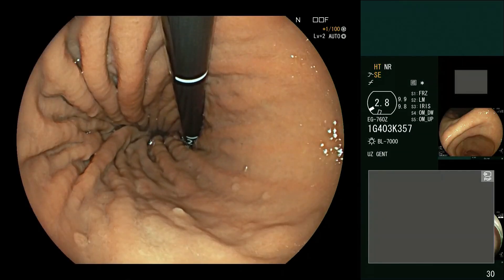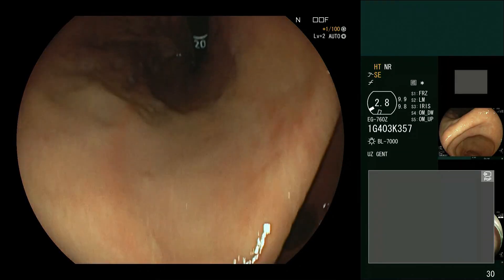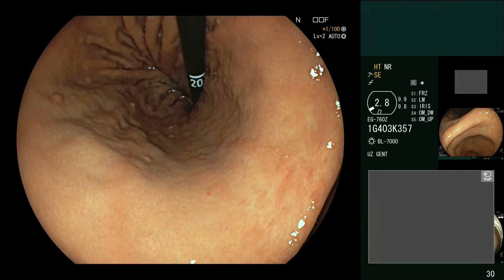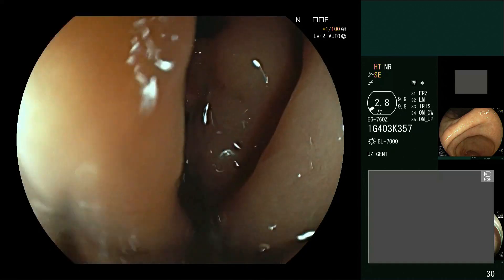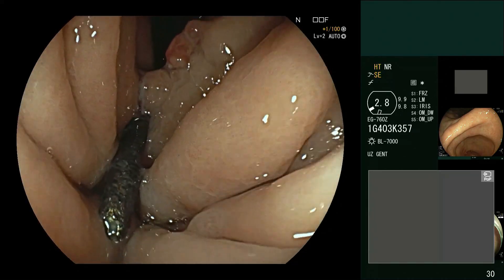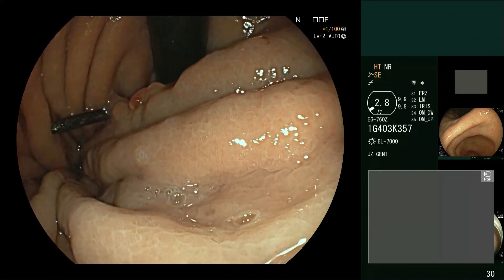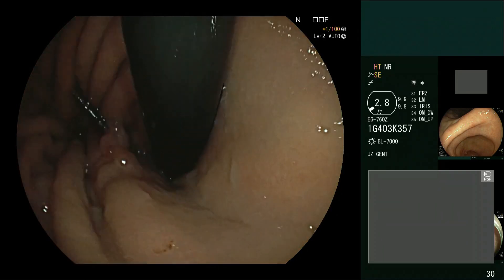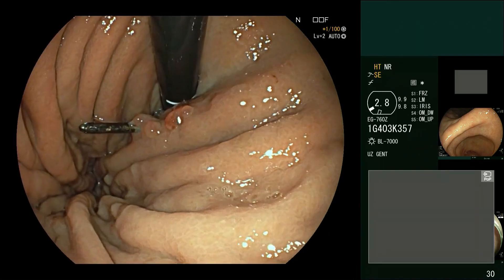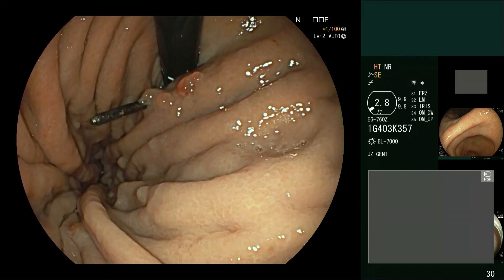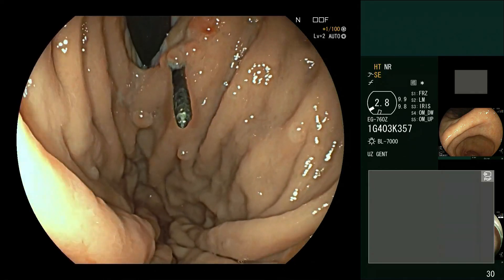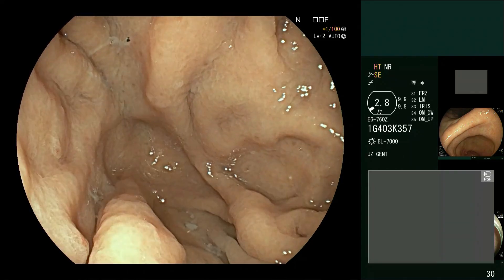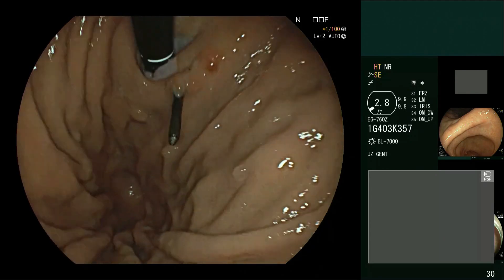You need to look in the body, and look up from the body, really including the part from the incisura up — pause and look. Then you need to expand the proximal stomach. This patient is highly sedated so cannot be asked to hold the air, and probably has a relatively incompetent sphincter which is stopping the air staying in.